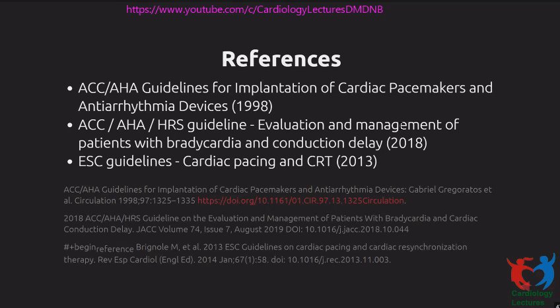Like I said, the only high-risk group that we can think of is patients with a reduced ejection fraction at baseline. Patients with a normal ejection fraction at baseline can also develop LV dysfunction or heart failure, some of them. Now, there's no strong evidence on the best way to prevent this. What we tend to do is try to pace them in a more septal location. Evidence is not very strong, but generally it results in a narrower QRS. There's some evidence that the incidence of LV dysfunction might be less. Again, it makes sense that pacing in the His bundle region might reduce the risk of LV dysfunction. Again, evidence is accumulating only now.